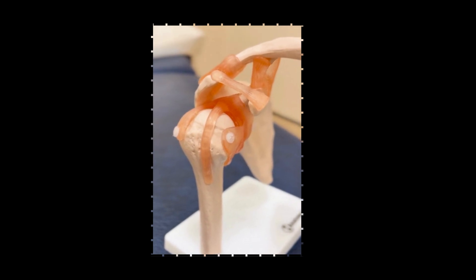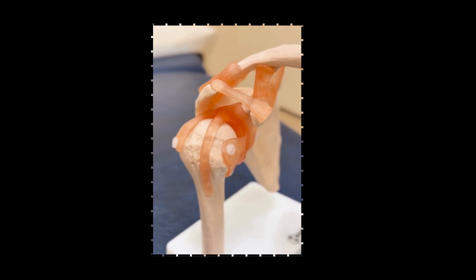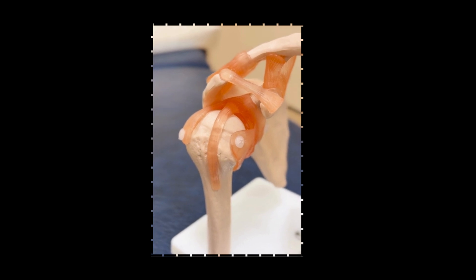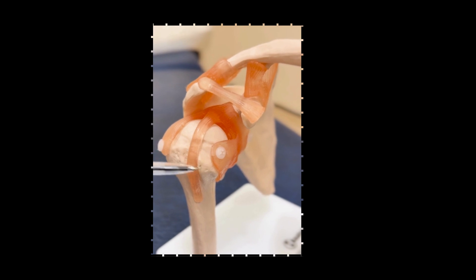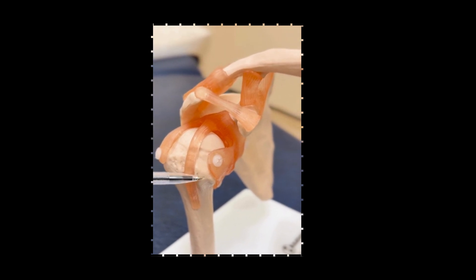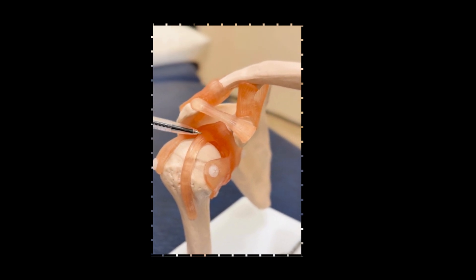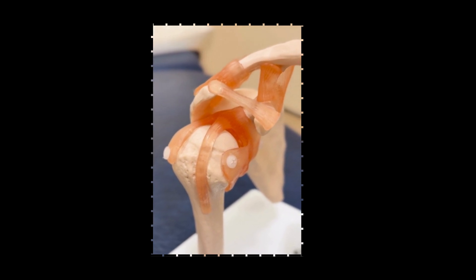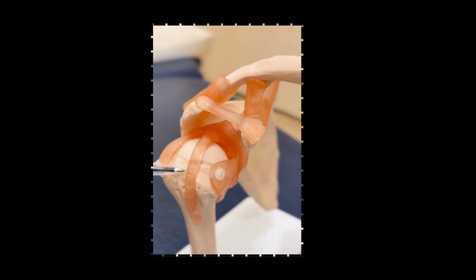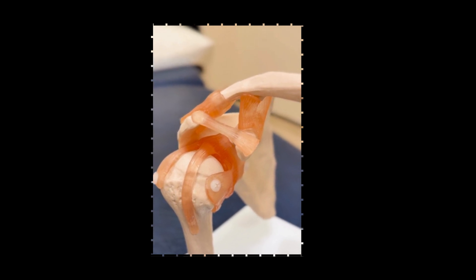I thought it would be useful to review the anatomy of the long head of biceps tendon before Dave talks you through a tutorial on how to evaluate this on ultrasound. What we're looking at here is the long head of biceps tendon sitting within the bicipital groove between the greater and lesser tuberosity, and we can see how it originates from the supraglenoid tubercle, the most superior rim of the glenoid itself, then travels across the top of the humeral head down through the bicipital groove and onto the humeral shaft.